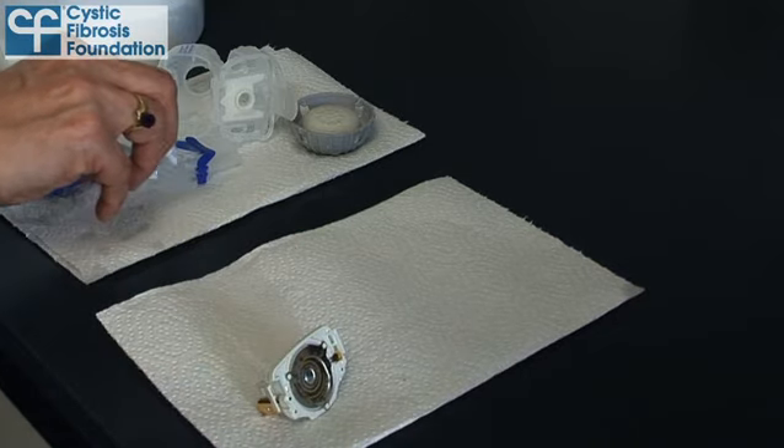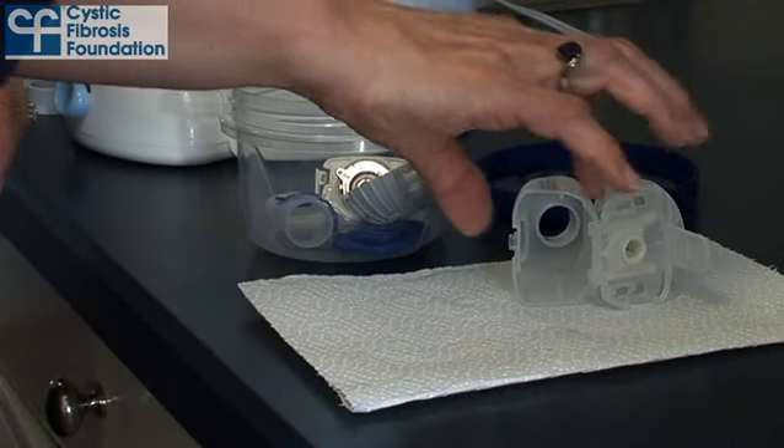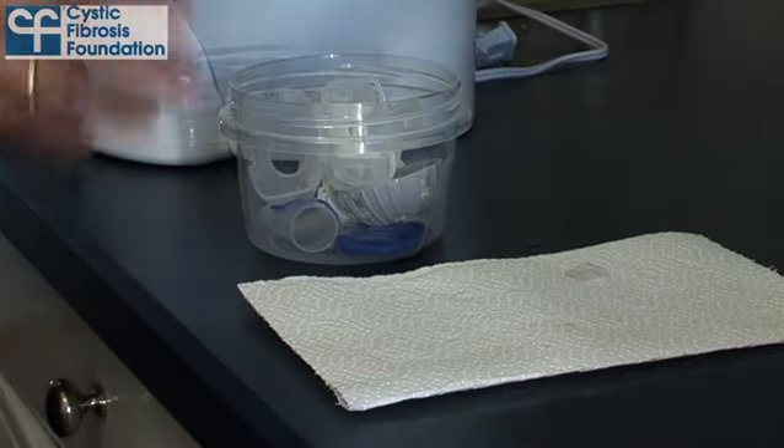Remember, germs will grow on anything that stays wet. Store the disinfected, air dried parts in a sealable, clean plastic bag or container until the next use.